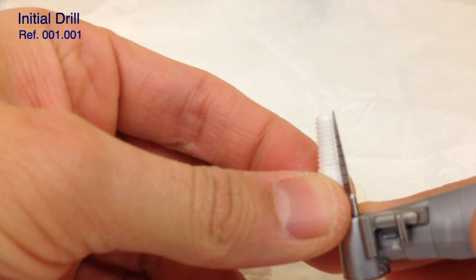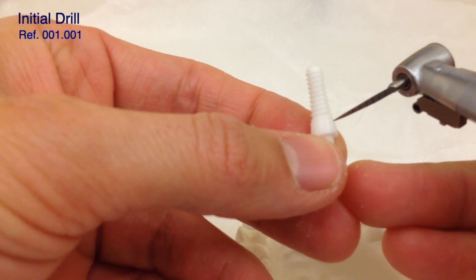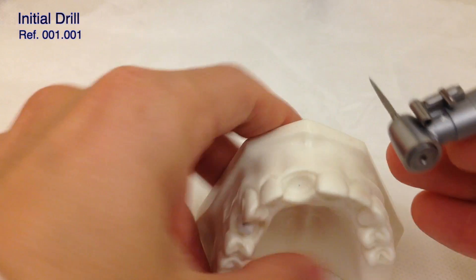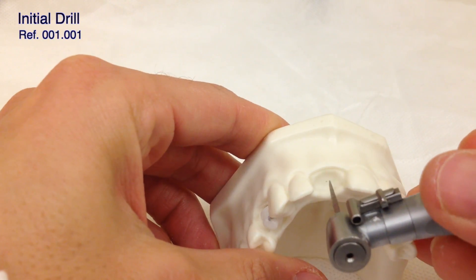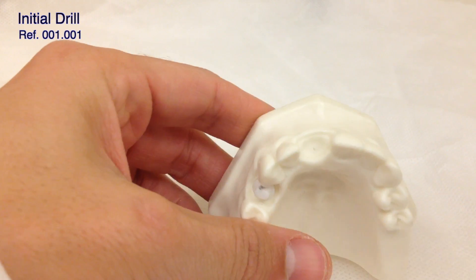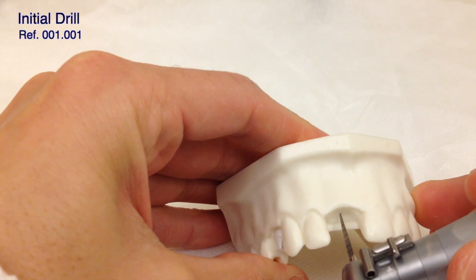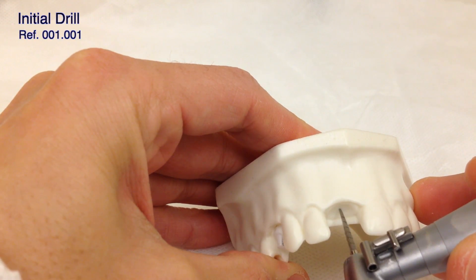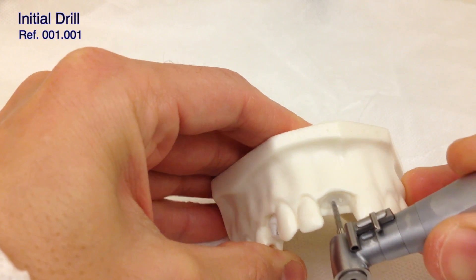Sometimes we have to use the drill extender for cases like this. To place a 12 millimeter implant we're going to use two extra millimeters more, so we're going to drill to 14. That way we are able to decide if we put the implant more or less deep. We start in the mark that we created before. Drilling speed is about 800 to 1200 RPM. We can do in the beginning six or eight millimeters of drilling.